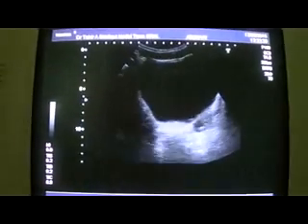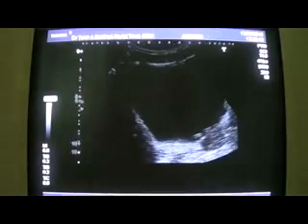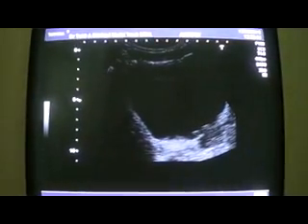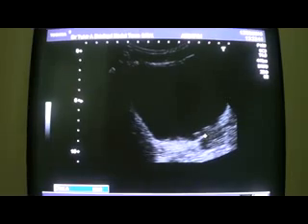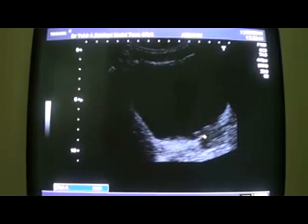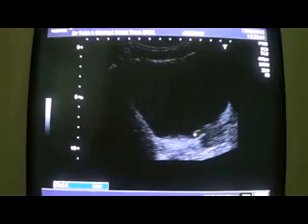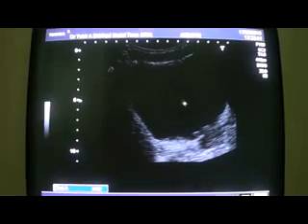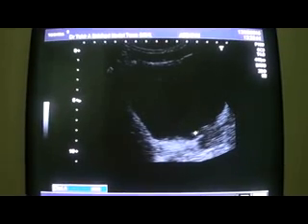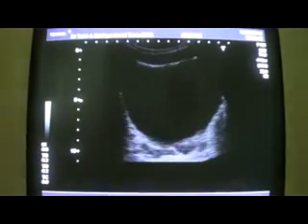This is the prostate, and here if you concentrate, you will see two tubular structures. This is the dilated distal left ureter, and this tubular structure within the lumen of the urinary bladder is the stent, and it is patent again. It's important to say.